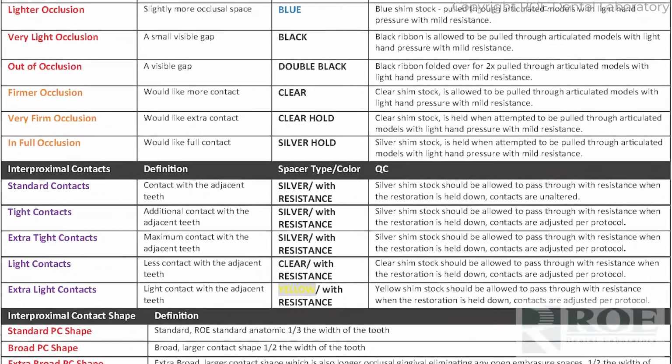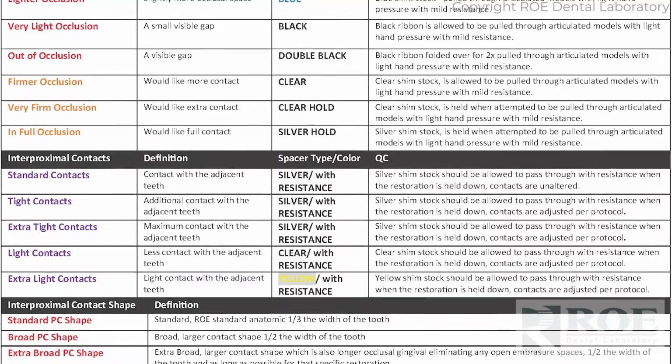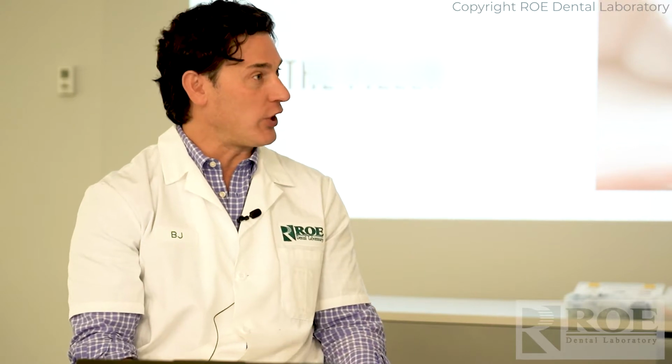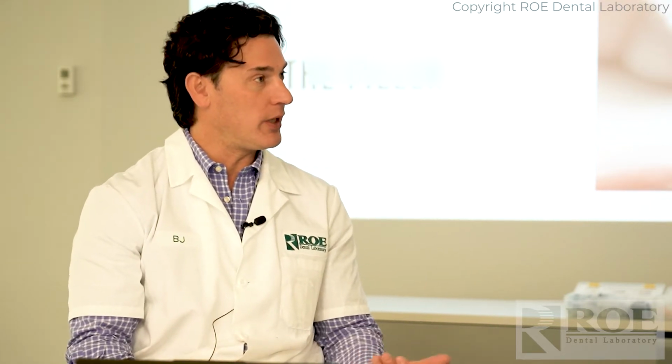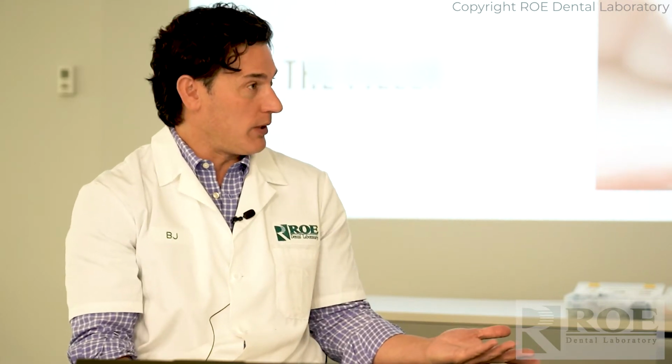I know you showed we have an elaborate system of codes for contacts to basically communicate through, and it's super important for people to read those codes. And then when a doctor is seeing things changing, maybe something changed on their end, and now contacts are a little tighter than they used to be, they just give us a call and we make a change. Yeah, everybody knows. Usually we make an announcement, hey, this doctor is having this problem. Let's make some changes, keep your eyes peeled for it, and let's solve the problem.